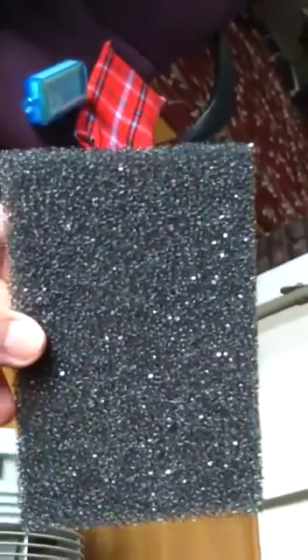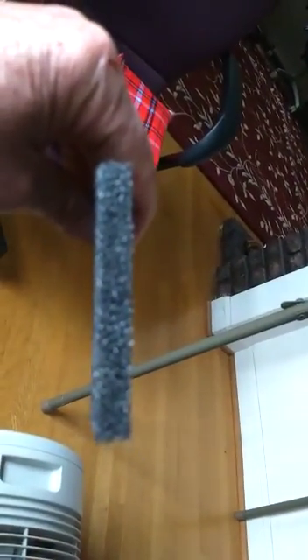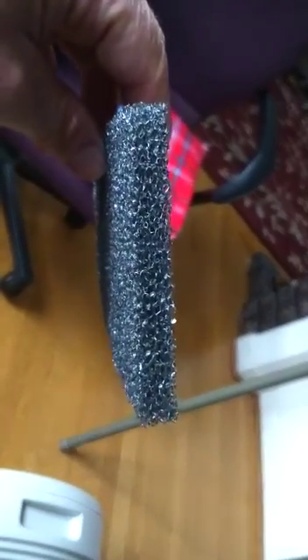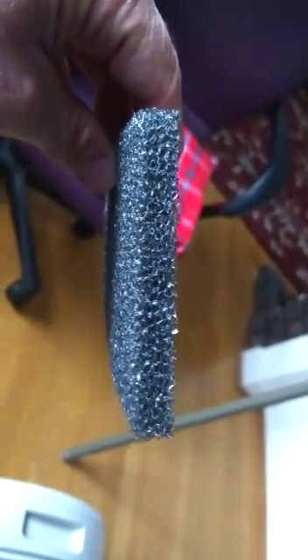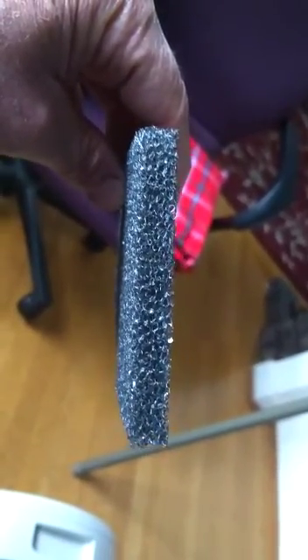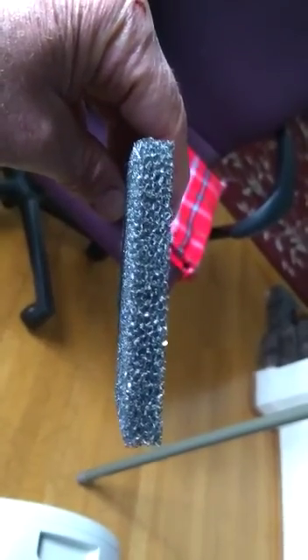Let's contrast it. For instance, this is material, and you can see there are two aspects of the filter, a pre-filter, on a cabinet filter for an oxygen concentrator. Now you can see the pores here. This is a 10 pore per inch or 4 pores per centimeter filter. That means they're relatively large holes.